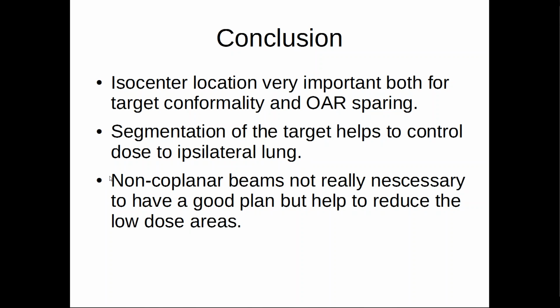So I did many tries, and for me non-coplanar beams are not really necessary, but I have the best result with it. Without non-coplanar beams, I have quality really near to this plan. Clinically, I think I might choose without non-coplanar beams because it's easier to do. But the best result for this competition was with the non-coplanar beam, so I chose to send this. So thank you very much for listening to me.